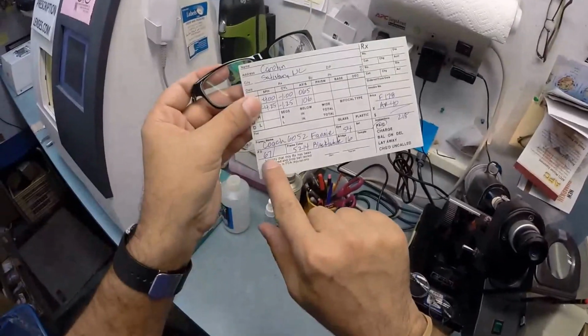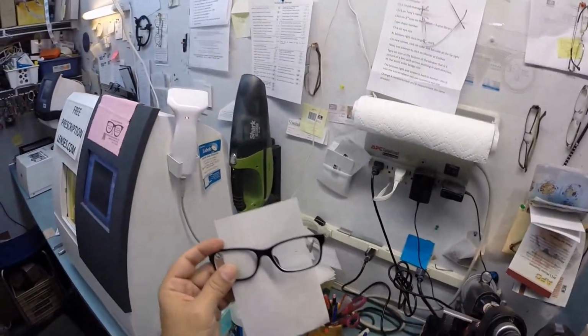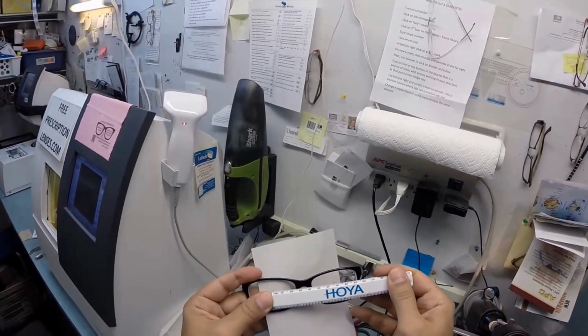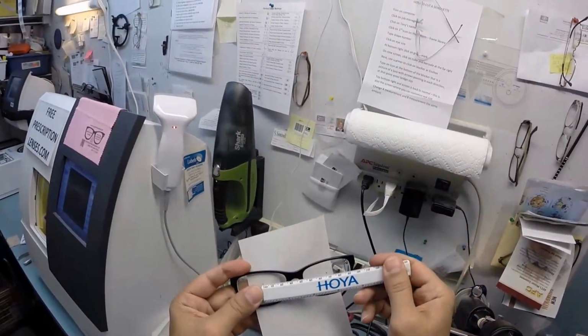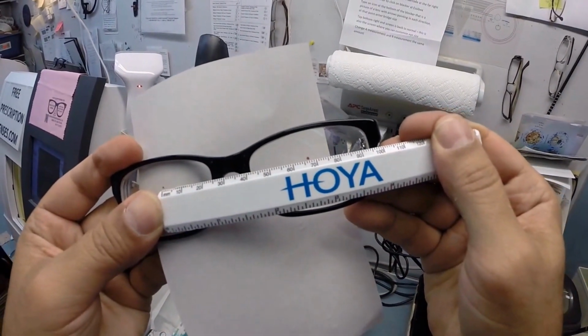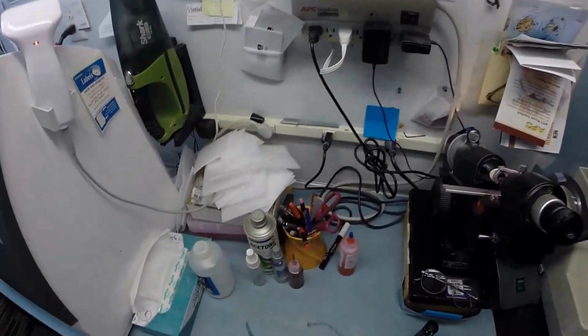All right, so your pupillary distance is 67. I'm going to turn the card around. I'm going to place my thumb against the PD stick against my thumb on your right lens, and then when we measure on the left, we're getting 67 millimeters. So that is made perfectly.